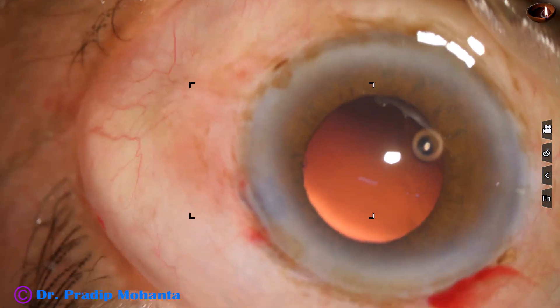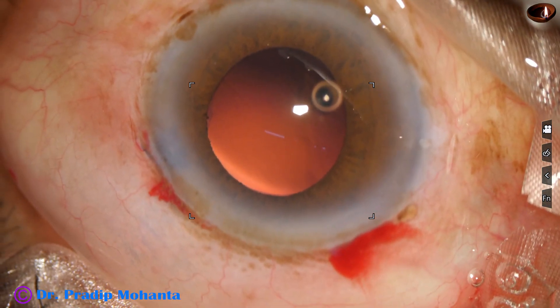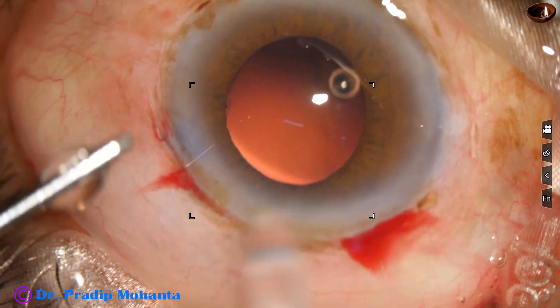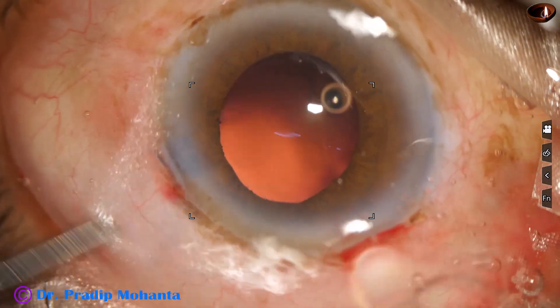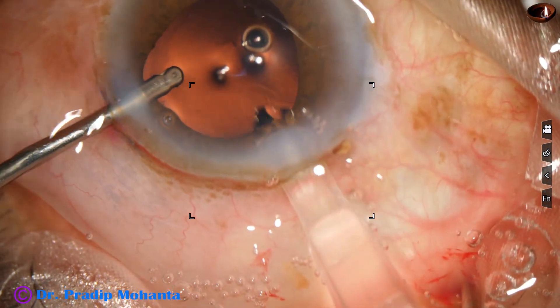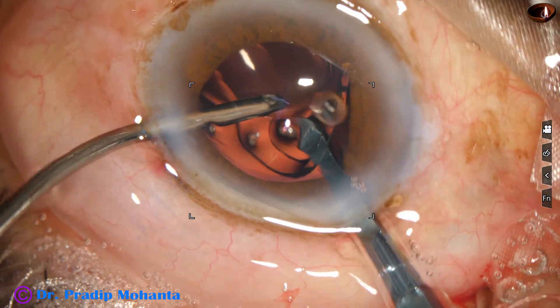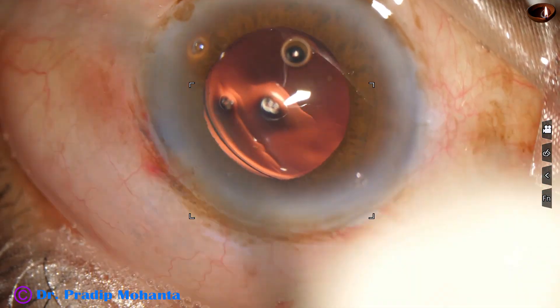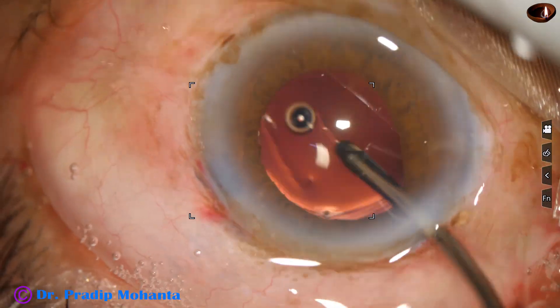And now an intraocular lens is to be implanted in the capsular bag. Though we prefer hydrophobic lenses, this patient cannot afford one. This patient is a farmer who could afford only 75 US dollars for the whole surgery. So we are implanting a good hydrophilic intraocular lens, and the lens goes into the capsular bag.